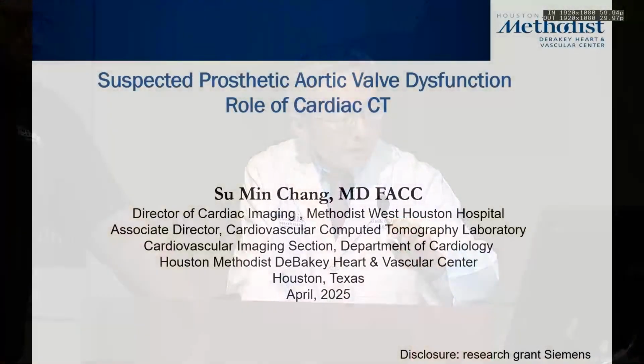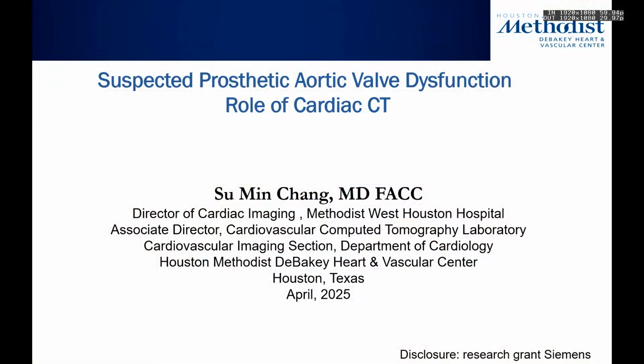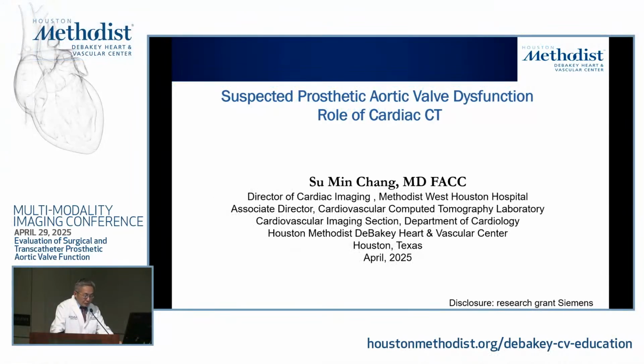Okay, disclaimer, my talk will be based on CT. I don't think I can do justice to Deepan or Muaz by talking about CMR or PET, which have their own place in evaluation and assessment. So I apologize if you expect me to talk about CMR or PET. I do show some pictures of it.